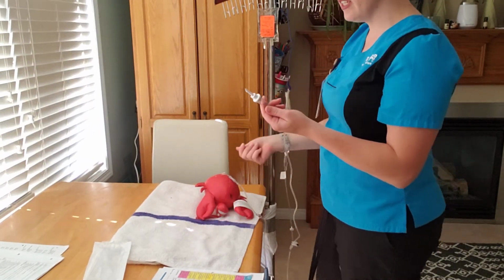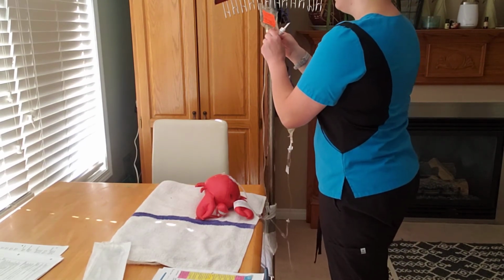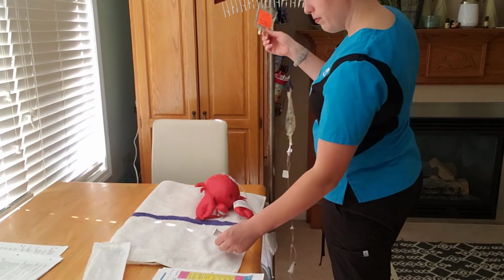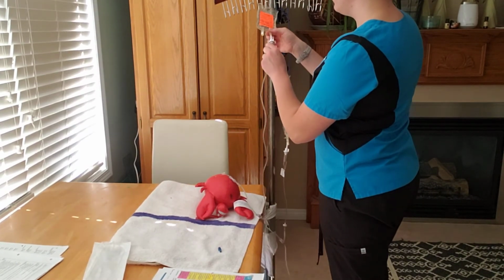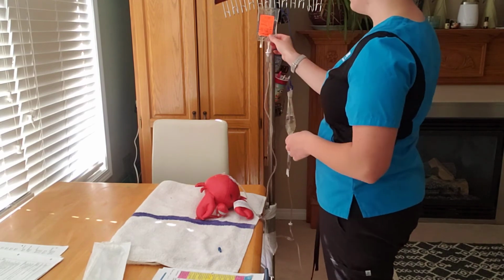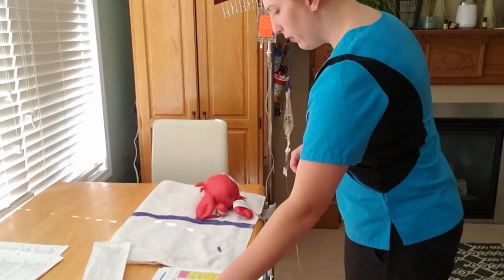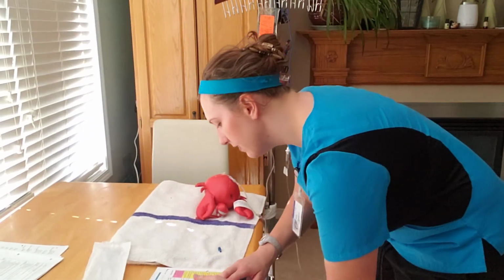I'm going to remove the cover on the spike, and now I'm going to spike my bag. So I'm going to pop off that blue cap, careful not to touch anything, and I'm going to work that in there. So now I've got my medication spiked. It's higher than my primary line. Before I do anything, I'm going to label this.